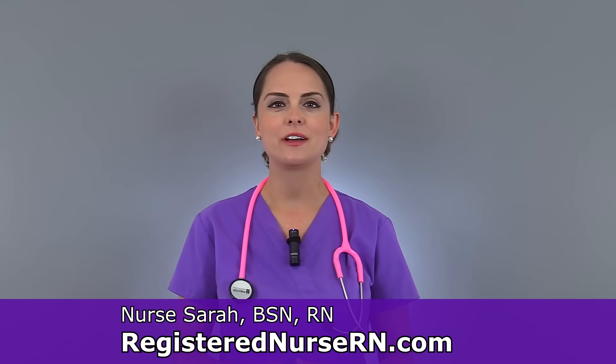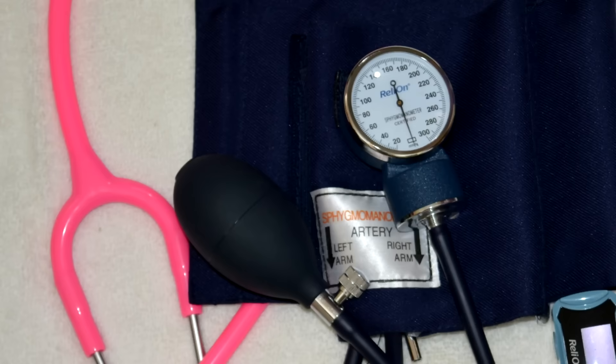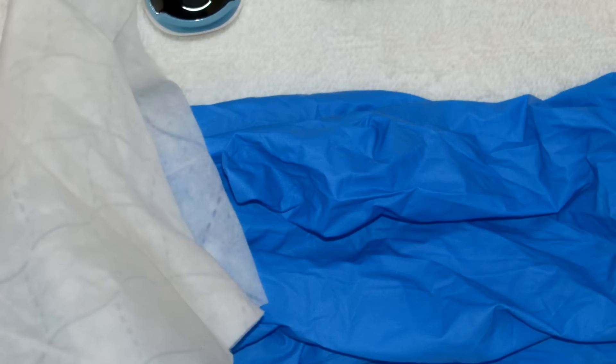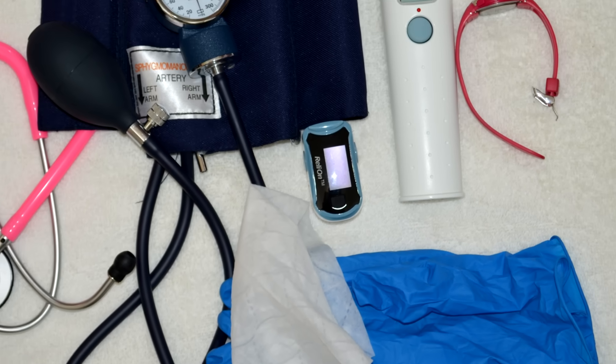Hey everyone, it's Sarah with RegisterNurseRN.com and today I want to demonstrate how to take vital signs. First, you want to gather your supplies. Typically you're going to need a stethoscope with a blood pressure cuff along with a thermometer of some type, a pulse ox, a watch, and some gloves along with a disinfectant wipe to clean the items that are not disposable.